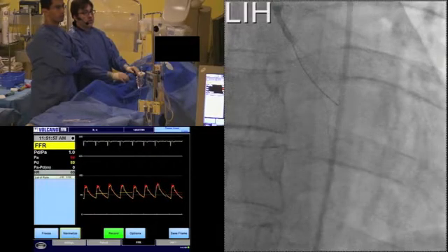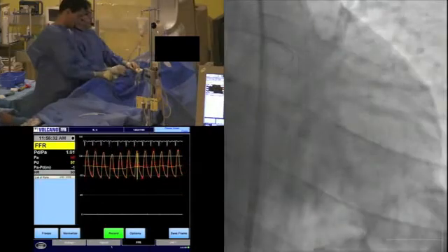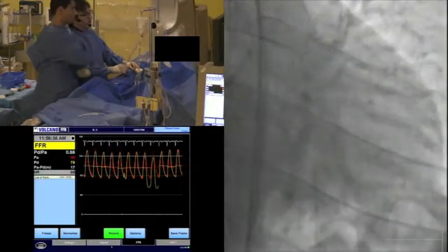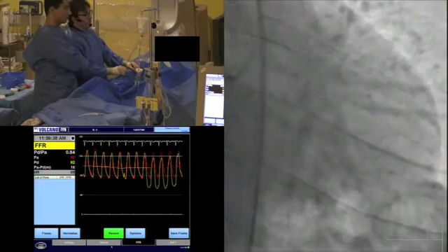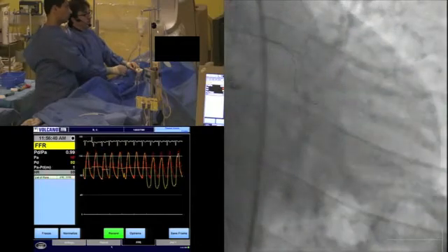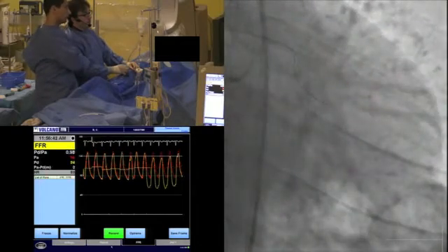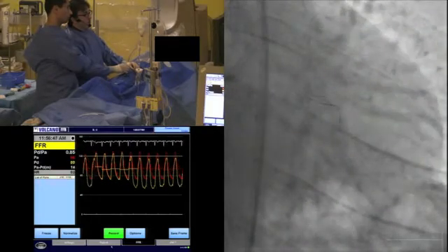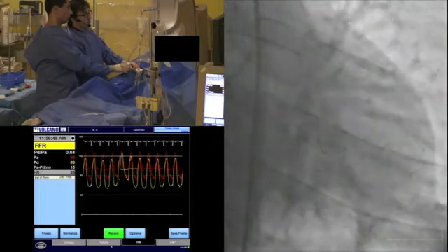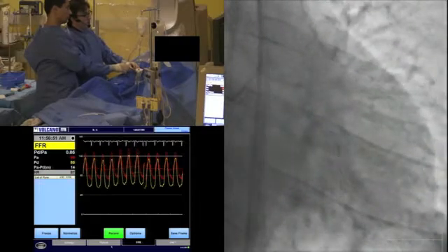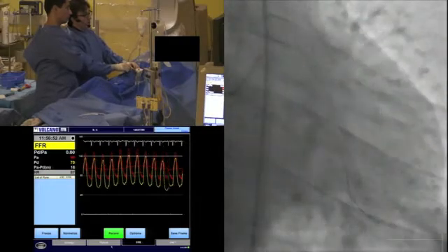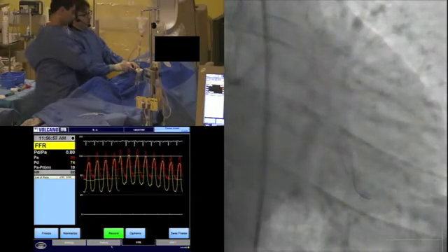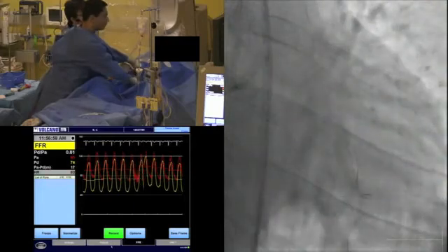So that looks great. I'm just going to loop things and straighten them up again. That little branch at the bottom there—I'm just going to push on, try and stay on that big branch for now.